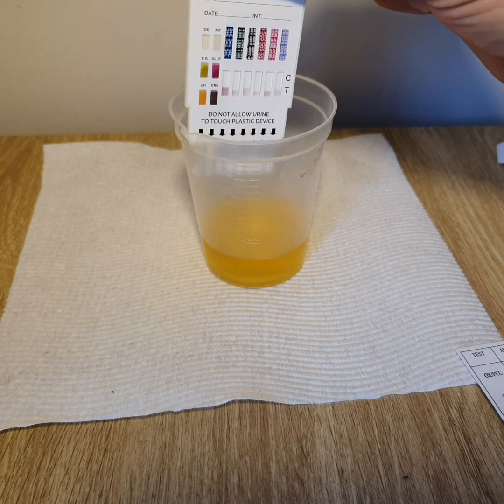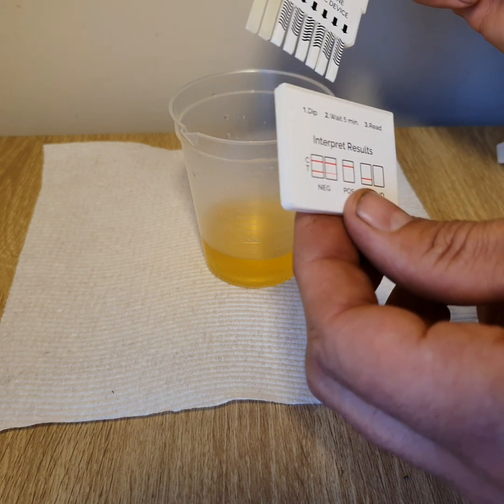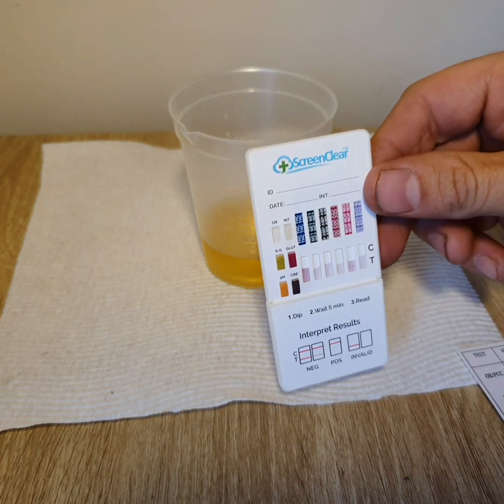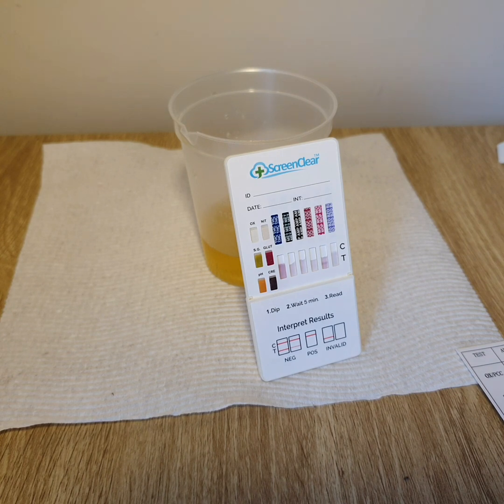So as soon as those strips have actuated, which looks like they all have, you can pop the lid back on or place it onto a flat surface, whatever you want to do, just so we can wait for the adulteration test to be done, which is usually in around about 30 seconds.